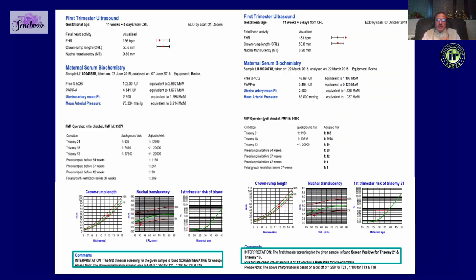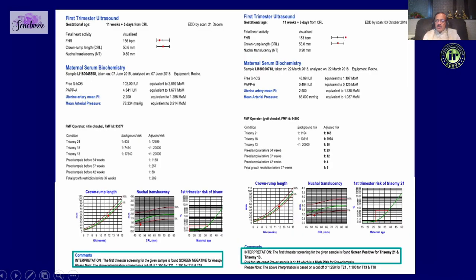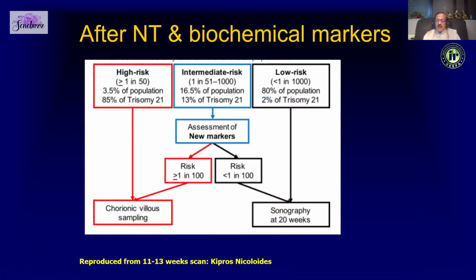We not only look at ultrasound features but also combine biochemical markers — that is the double marker: free beta-hCG and PAPP-A — to get an adjusted risk. Here we have an adjusted risk which is very low, and here we have one which is very high at 1 in 165.